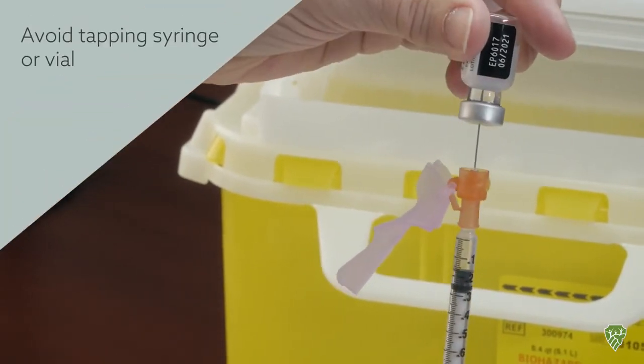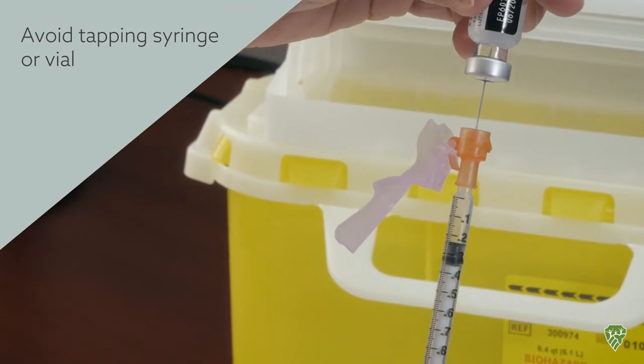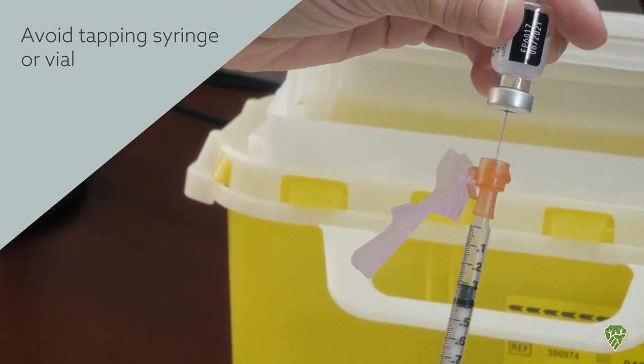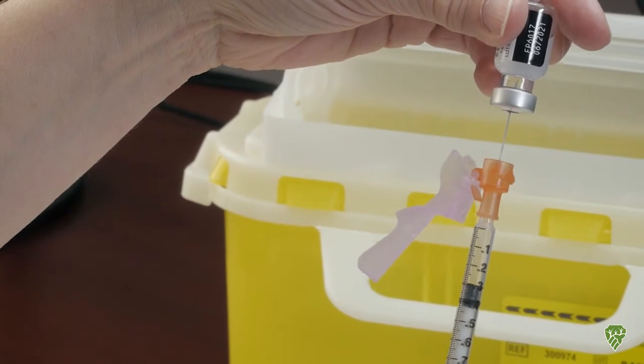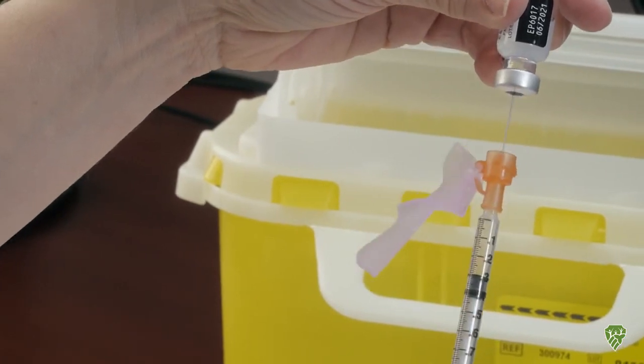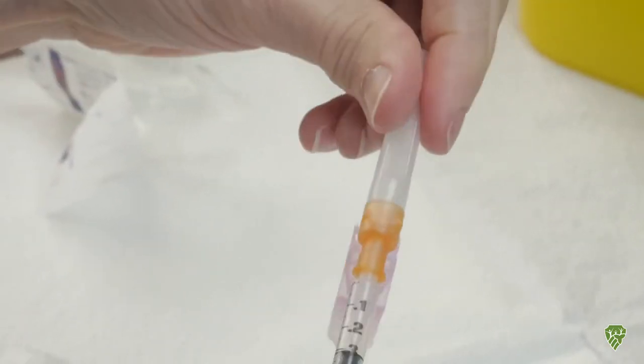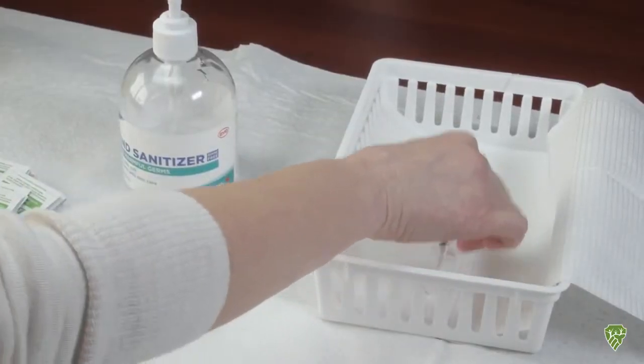We don't want to tap the syringe or the vial at this point, and get exactly the 0.3. Then we set that aside for immunization.